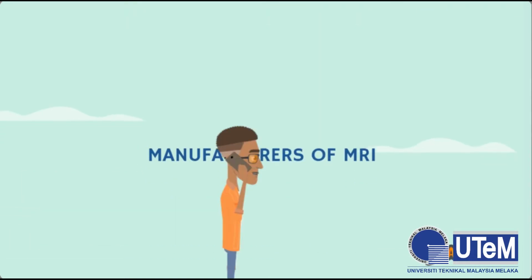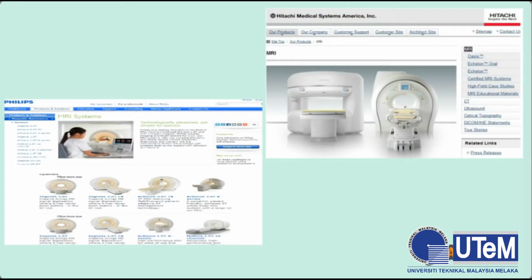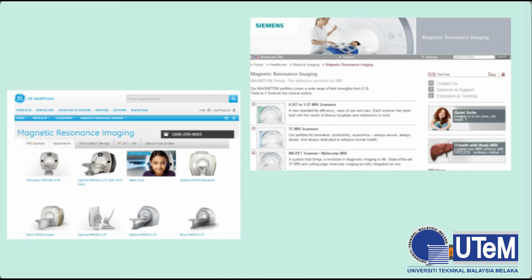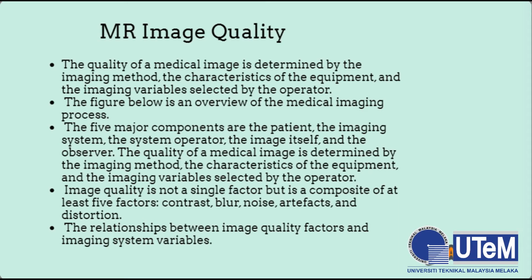Manufacturers of MRI: there is Hitachi, Philips, Siemens, and a few other companies. MR image quality: the quality of a medical image is determined by the imaging method, the characteristics of the equipment, and the imaging variables selected by the operator.